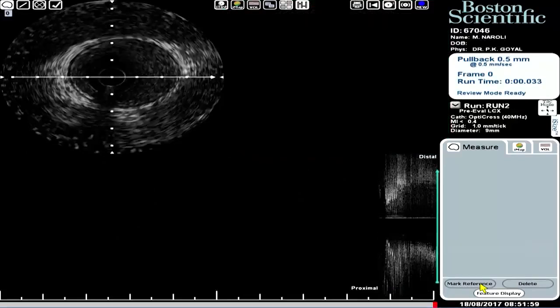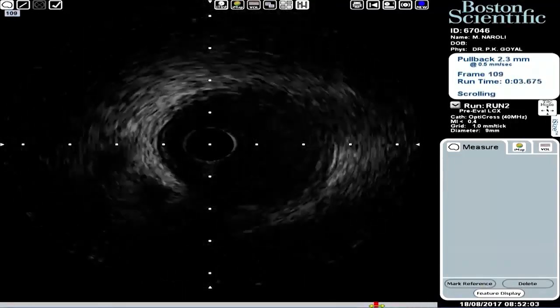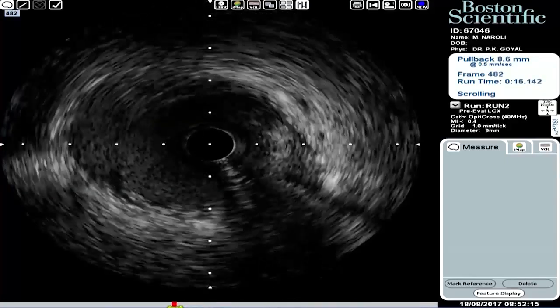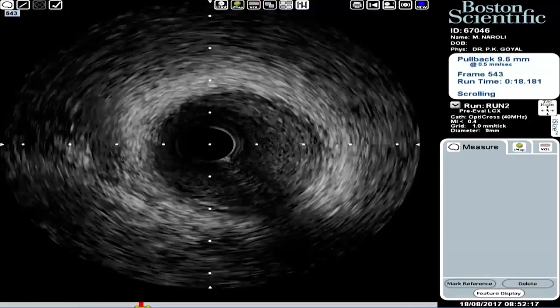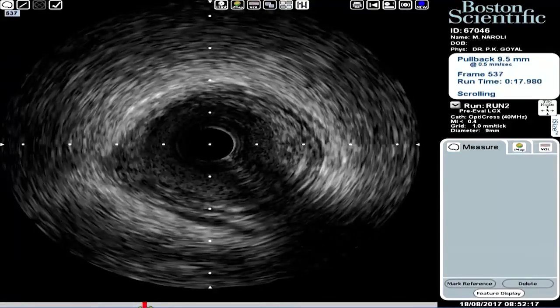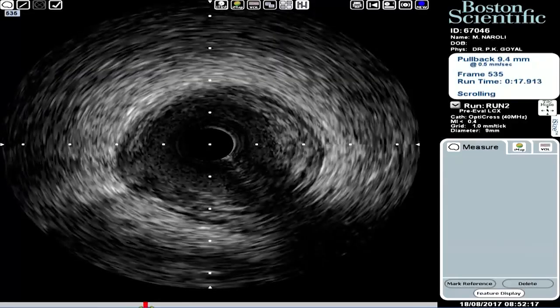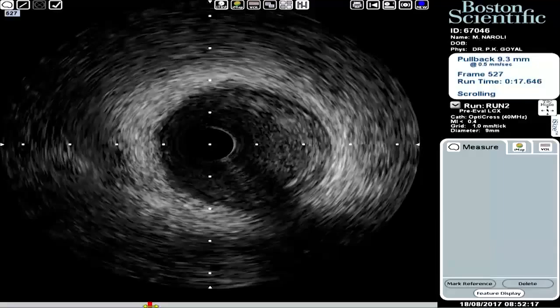So this is 110 as you call it. You see, all these are bifurcations. This bifurcation is 110. It is not 111, that I agree. Now having seen this, my thought is I will do some balloon, probably a cutting balloon. I prefer cutting balloon on ostial diseases because the LAD ostium is involved.